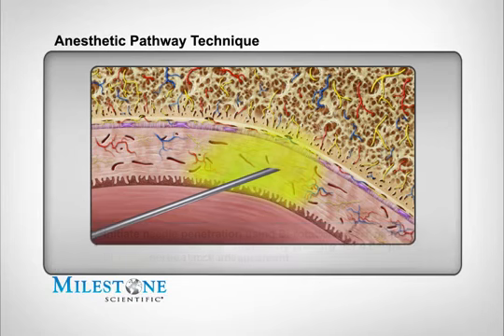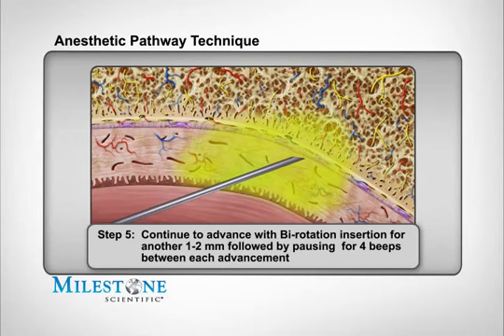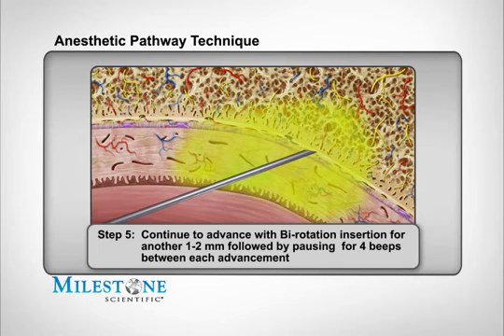Step 5: Continue to very slowly penetrate the palatal tissue with a gentle back and forth rotational movement while simultaneously advancing another 1 to 2 millimeters before pausing once again. It should take anywhere between 8 to 10 seconds to reach bone, depending on the thickness of the palatal tissue.